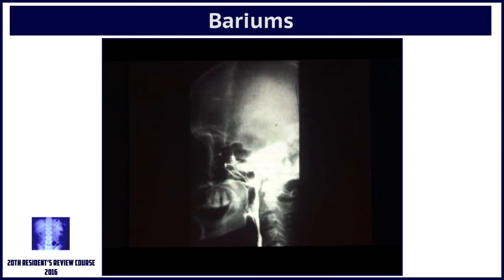This is the soft palate here. The soft palate is supposed to rise and close like a trapdoor. I'm using the word trapdoor because that is a beautiful analogy. And in this patient, there is palatal palsy along with pharyngeal palsy, and the soft palate has not risen up, and there has been reflux of barium into the nasopharynx and from the nasopharynx into the nasal cavity, in fact. It doesn't matter where it goes from.